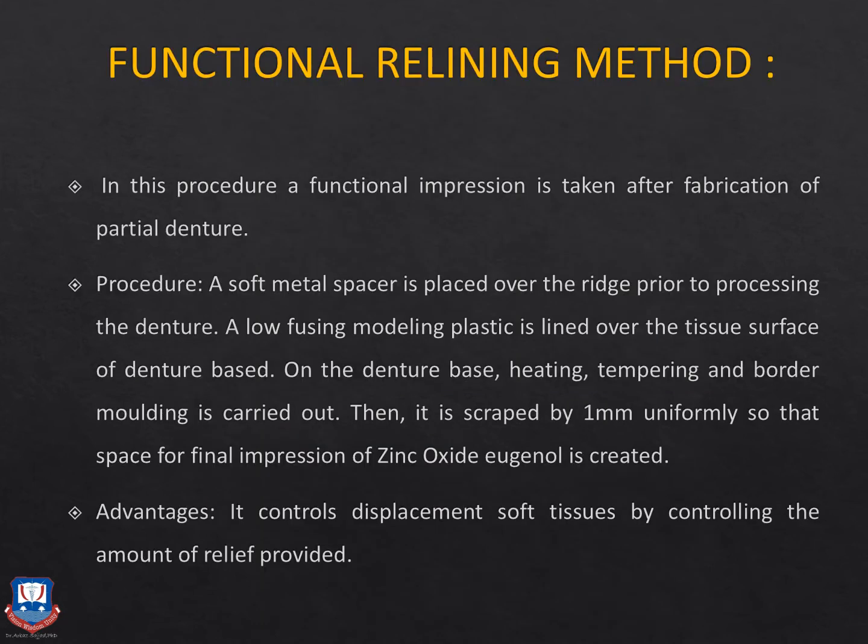Either at the trying appointment, that is during the cast partial denture teeth trial, or at the denture insertion appointment, relining is done under the RPD, that is, on a distal extension basis, with a suitable impression material such as monophase or medium body silicone. And then the denture is flasked, the relining impression is removed, and that area is filled with a fresh layer of acrylic resin.